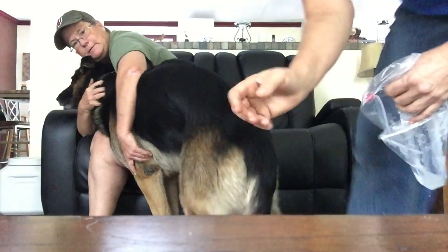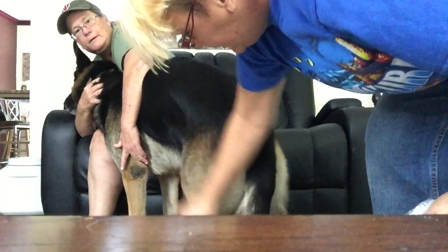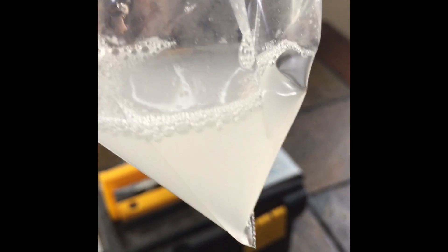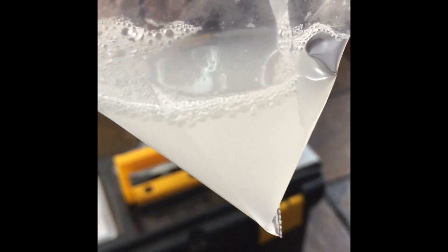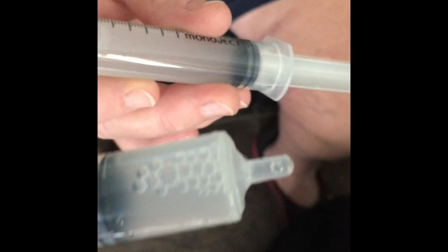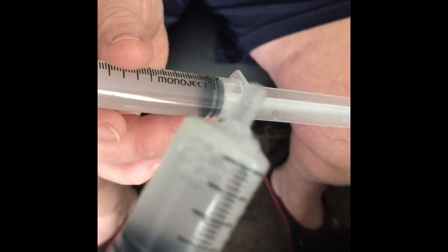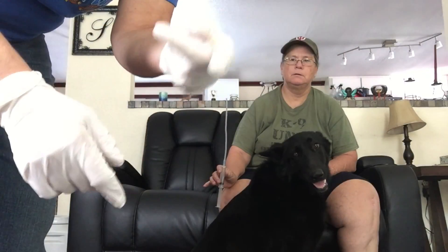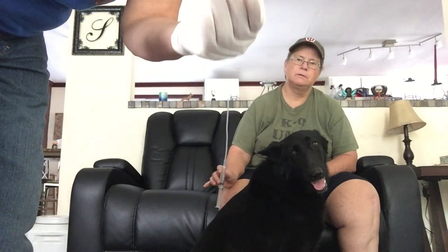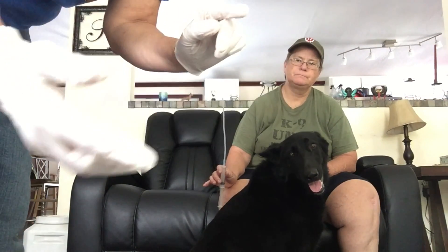Make sure that his penis goes back in so it doesn't get stuck out. This milky look is what you want. He's got quite a good output. We're going to suck this up into a syringe and go ahead and put it inside to impregnate her and hope for the best since she's ovulating. We have two syringes. I emptied out the fluid and then just had semen in there. Put some gloves on so you don't get any bacteria into the vagina. And use non-spermicidal lube — I'm going to lube the tube and then place it inside her vagina.